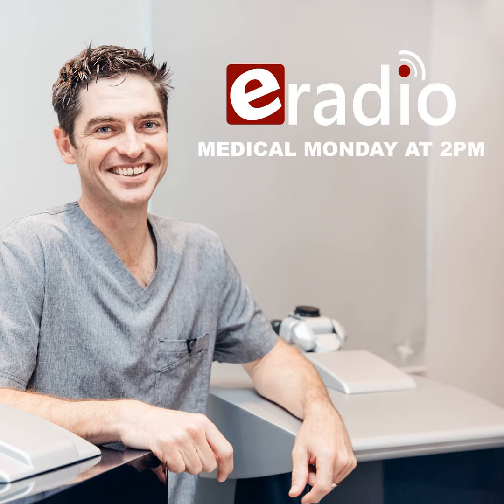If you remember the session a couple of weeks ago talking about myopia and hyperopia and how we change the shape of the eye, either flattening in the center or steepening in the center to cause the light rays to fall either forward or behind that point that we're targeting. That's what the excited dimer laser does.